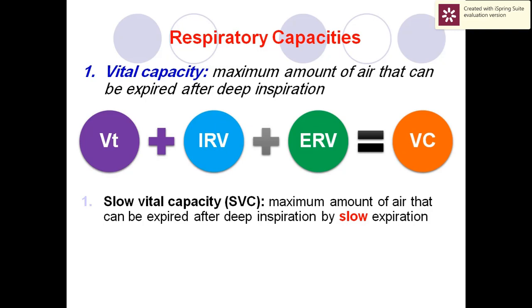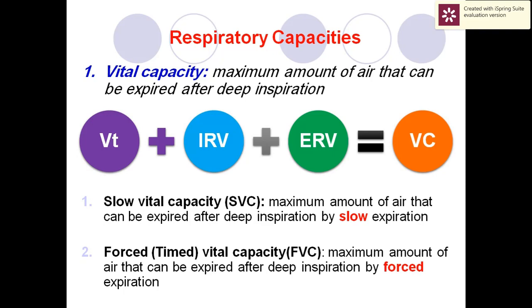في عنا طبعا الفيتال كاباسيتي في slow vital capacity وفي forced vital capacity. الفورست فايتال كاباسيتي اللي هي احنا بنخليها البيشنت يعني المانوفر يعملها during spirometry test. طبعا للمعلومة يعني spirometry only is available in Gaza hospital. في واحد يعني موجود في مستشفى ناصر وفي الشفاء.